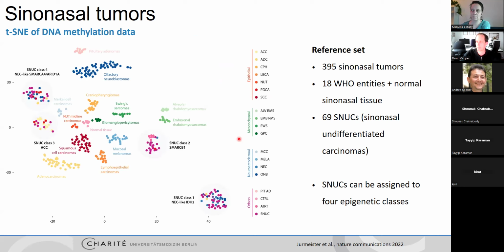So we are currently using methylation in many of these instances to predict what type of alteration we will detect in this tumor. And this is very beneficial for brain tumors because we have a huge range of different types of cancers, and it's possible that it will also work in other types of tumors. But there will definitely also be further layers.